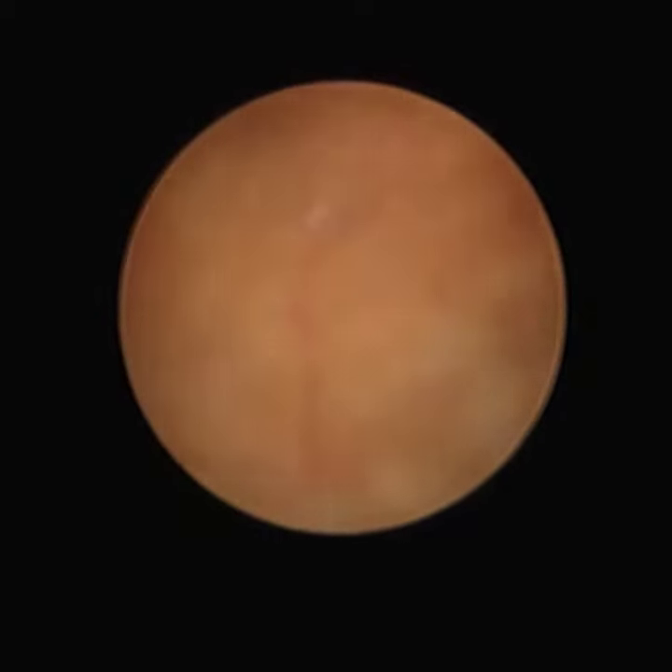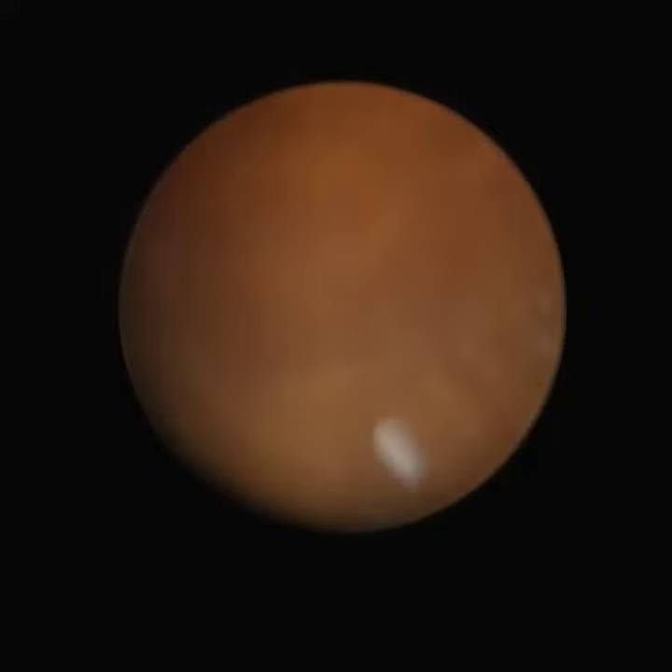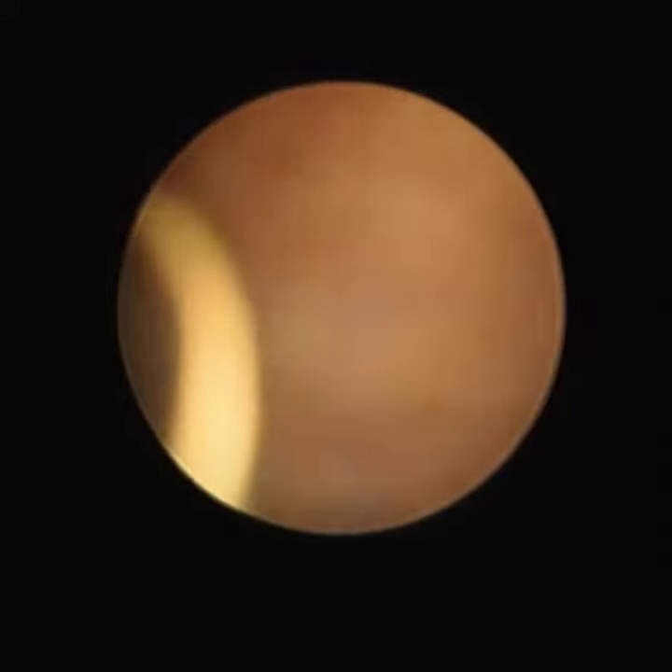During the course of insertion, the cystoscope should be at the center. The lumen should always be centered. We should not hitch the sides of the urethra.